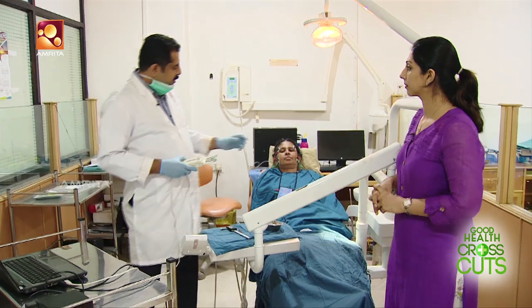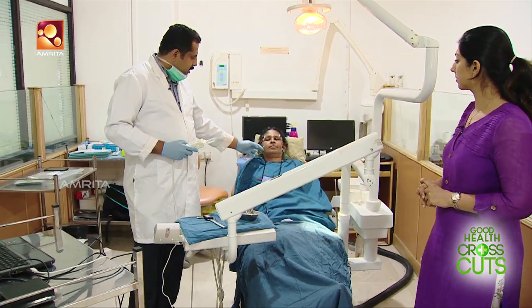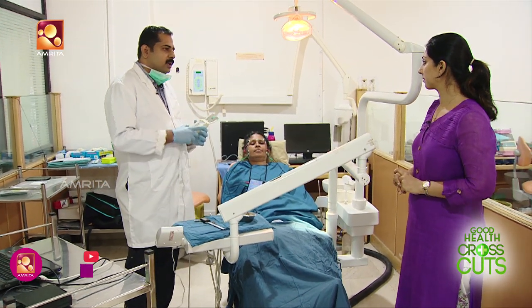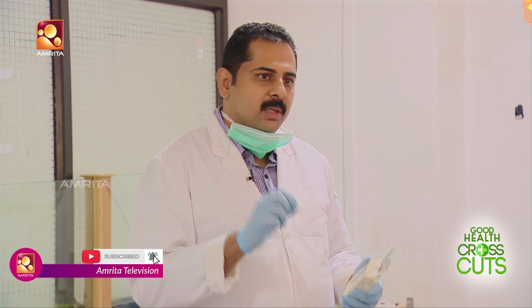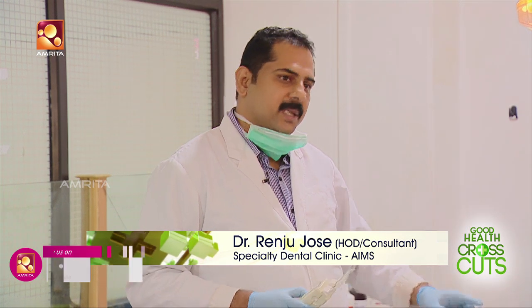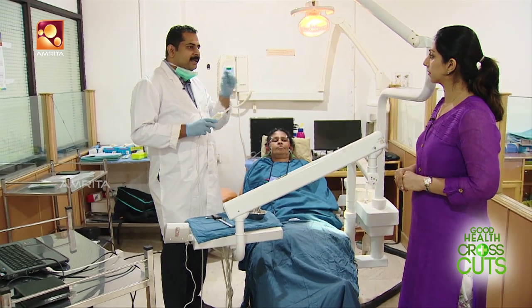In this patient, the muscles are connected to the computer. The sensor is connected to the muscles on the same side. The strength of the bite is also connected and measured through the sensor.